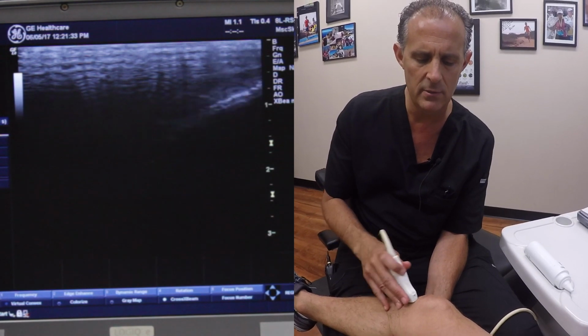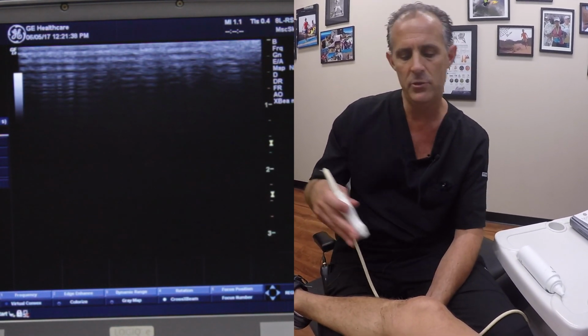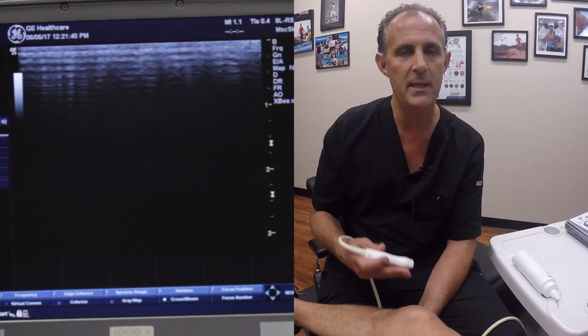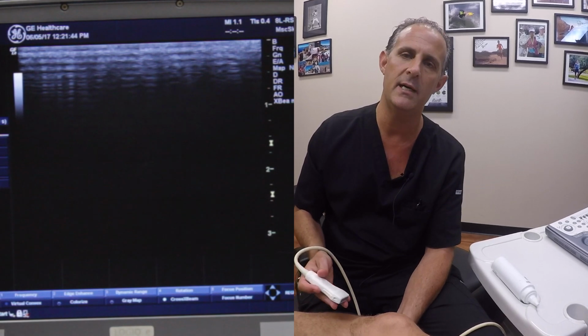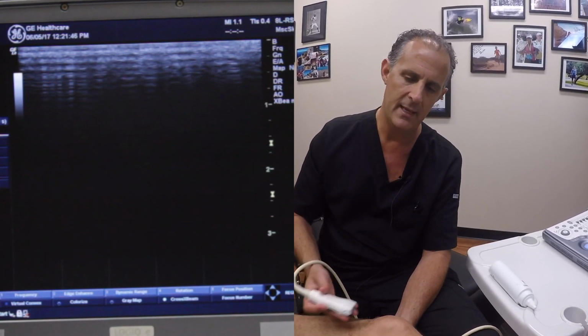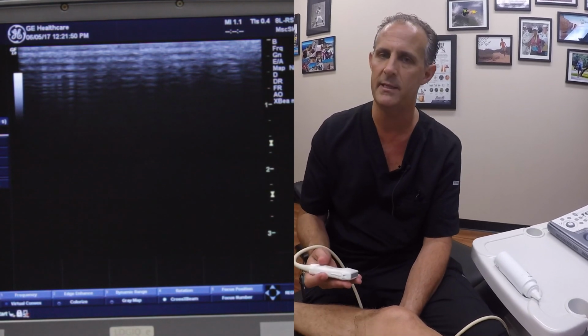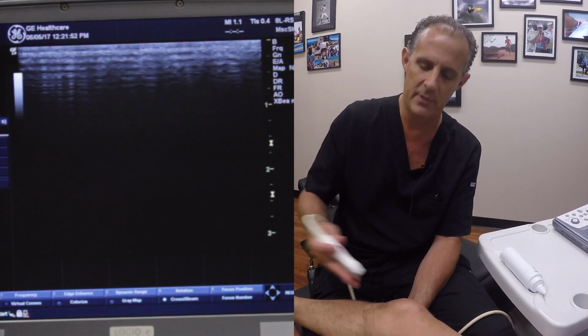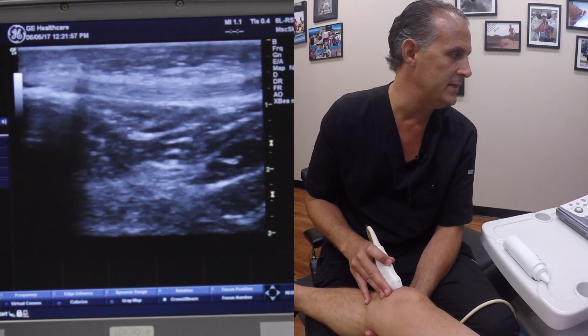Ultrasound is also an amazing advantage over the MRI in the sense that we're doing it on the spot at the bedside. MRI is an expensive test. Oftentimes you have to be sent out either to the hospital or to an imaging center, and there's a process involved to get it back and get the information. Whereas with ultrasound, we're in the clinic, we suspect something, and we just get right in and look right on the spot. Yeah. So that's one of the main advantages of ultrasound.